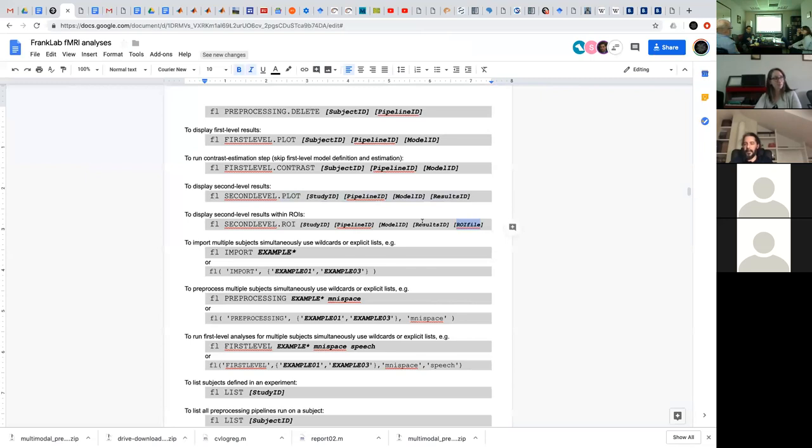I believe you were saying that you can make an argument that the ROIs that we get, like our cortical ROIs that we get using FreeSurfer, aren't really individual. But in that case, you'd have to have them all mapped via the FS average surface, right? Well, that conversation. Yeah, right.